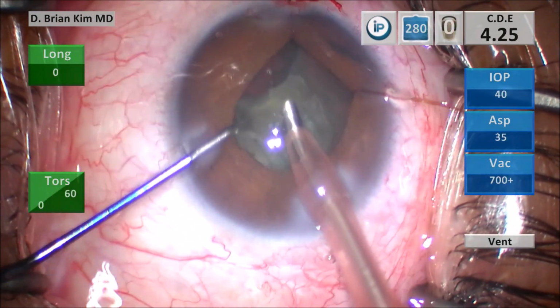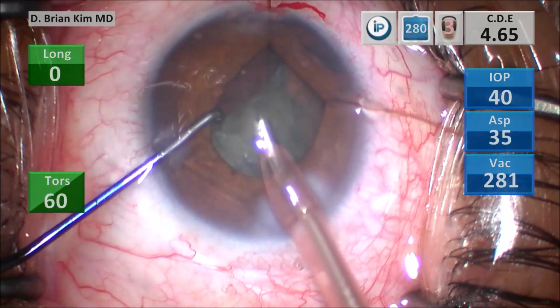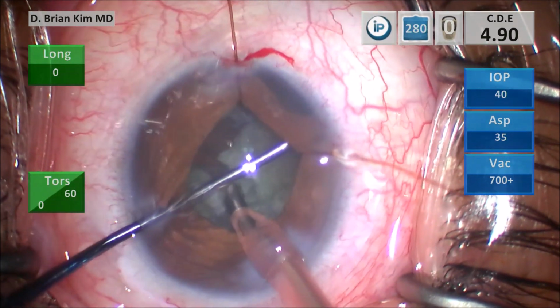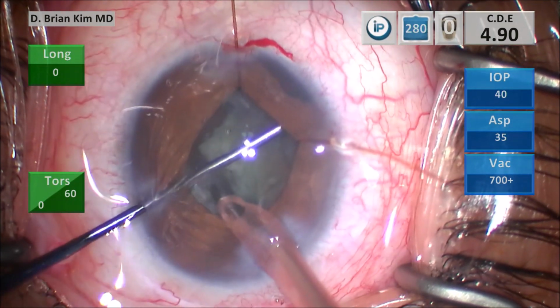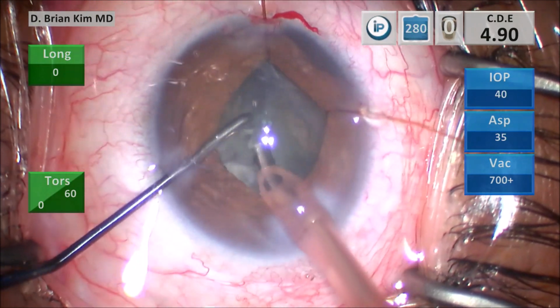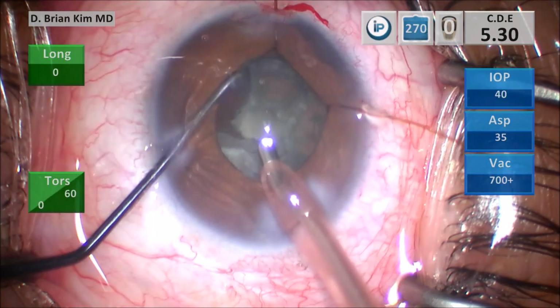In the case of potential zonular disease, you never want to bring the phaco-tip towards the capsular bag because you can just suck up the bag if there's no zonules. Remember, the zonules are providing counterforce, pulling the capsular bag peripherally. If you have poor zonules, as you initiate vacuum, the capsular bag can come right up and then you can rupture the posterior capsule.